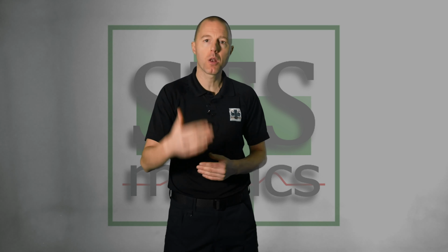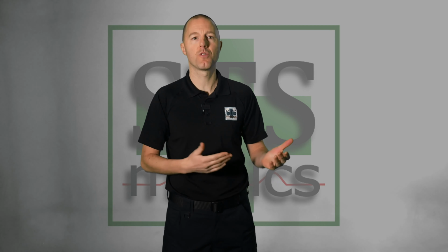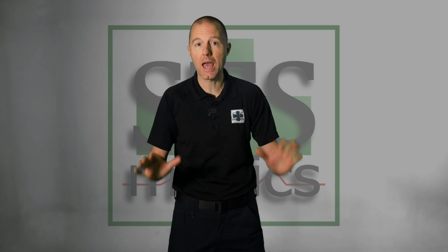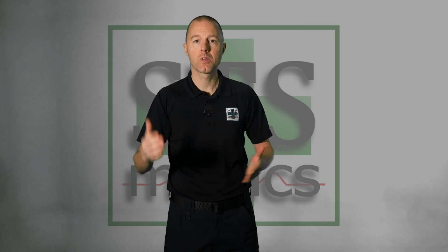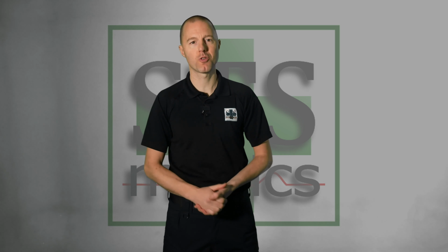We do not have to assess what is going on inside the body. All we have to do is apply the AED if someone is not breathing, and the AED will make the decisions for us. It will not shock anybody with a healthy heartbeat. It will not shock anyone who has been dead for some time. It will only shock them if they need it. No decisions for us to make. Simply apply the AED if they are not breathing and follow the instructions.